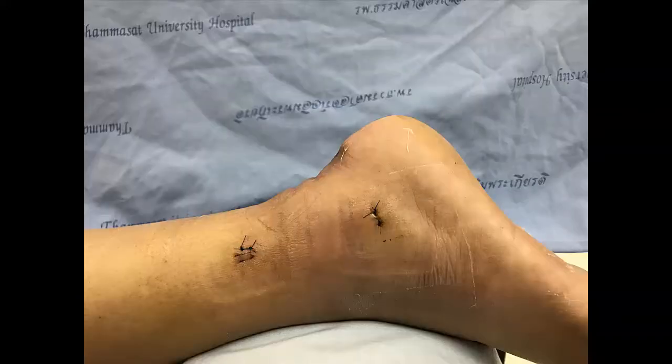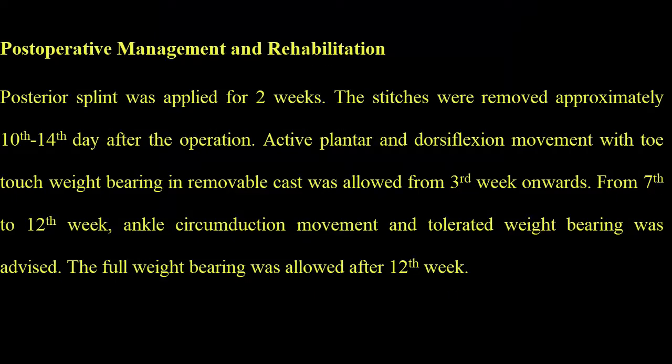After the completion of the procedure, a non-absorbable horizontal mattress suture was applied and a posterior splint was applied. The patient in this video had quick recovery in terms of pain and swelling during the second week follow-up.